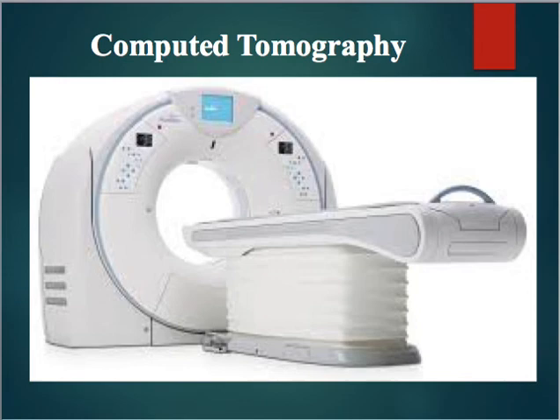We usually use X-ray to look at our bone, we use ultrasound to look at the soft tissues, and then we use angiography to look at the blood vessels. So the great thing about CT is it combines all of those things into one imaging modality. CTs are going to give a lot more detailed information than a plain film X-ray would, but the big trade-off is that CT scans use a lot more radiation than regular X-ray, and the cost is a lot higher. So those are things that we have to weigh out when we're doing imaging.